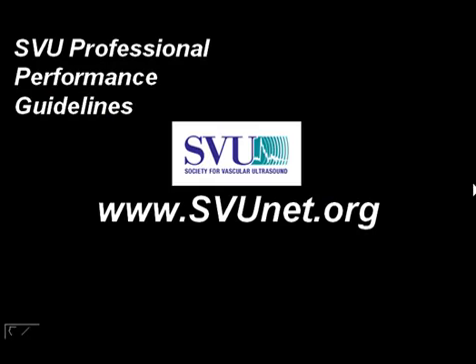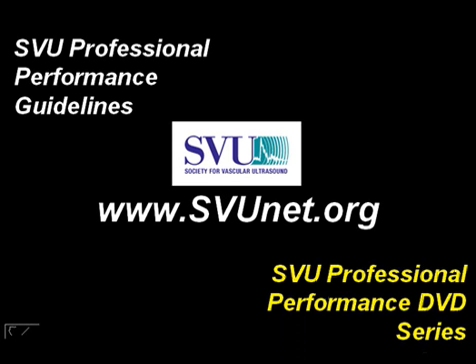Now that's the evaluation of the patient with carotid artery disease in terms of the use of carotid duplex ultrasound. If you want more details about these professional performance guidelines, I would refer you to SVU's website. That's www.svunet.org, and very soon we'll have some DVDs that will also go over the technical performance of these examinations.